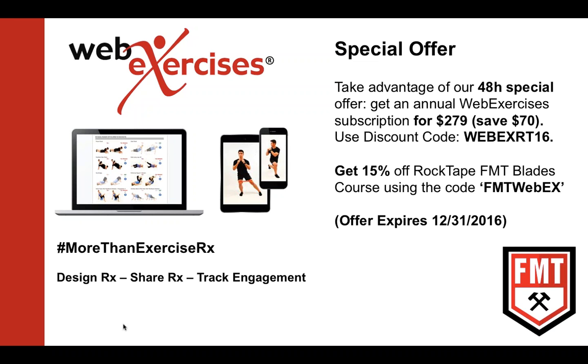So for instance, if I had an athlete come in and they're having some Achilles tendinopathy, which is common, I may try to mitigate their tendinopathy pain by tooling back there with very light, fast strokes. And then I may do some isometric exercises after that, and then take them through some eccentric loading programs or eccentric-concentric loading programs. So we feel the tool itself is a good way to start. And it may be day one.